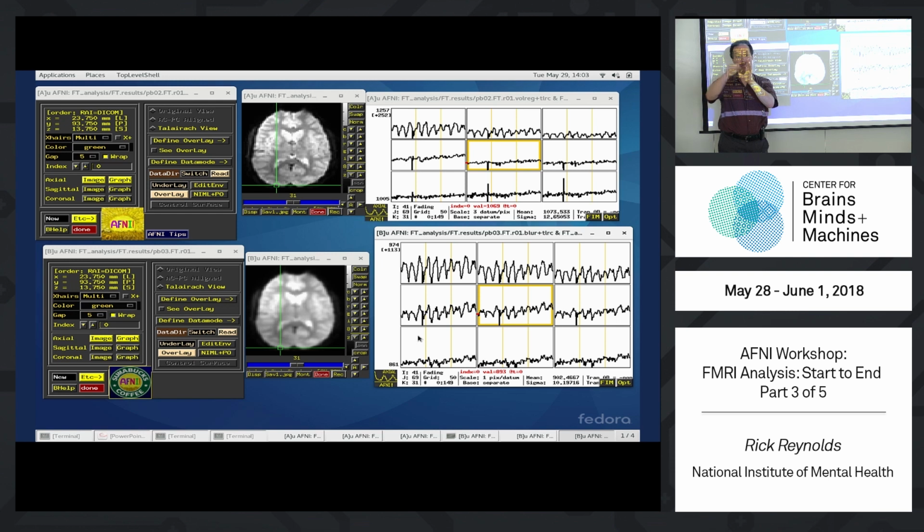When you resample, you're resampling into the middle of voxels, so you only have 8 neighbors at that point, because a voxel coordinate is going to be in the middle of 8 voxels. But here you have a central voxel that's not moving, and you have 6 first neighbors, and I forget how many other neighbors, but 27 voxels are involved here, and then you have your farther neighbors too. But anyway, in 3D space, you could have more voxels with nice curves.